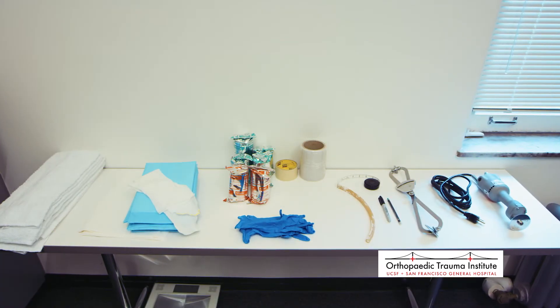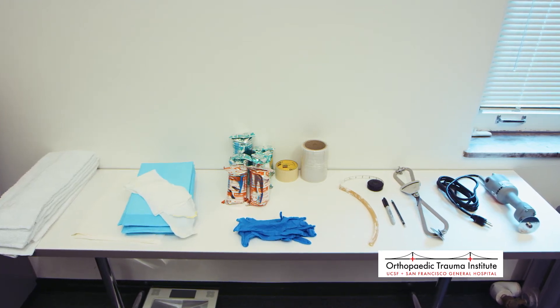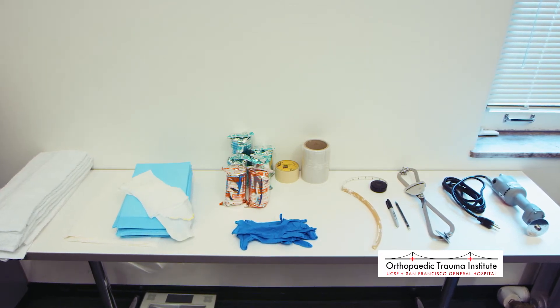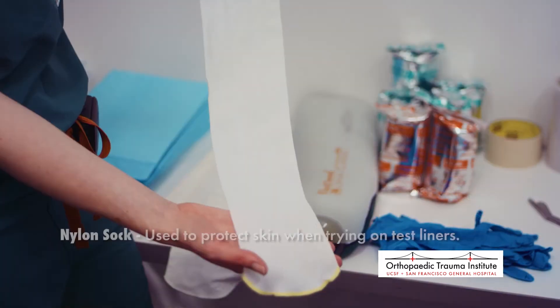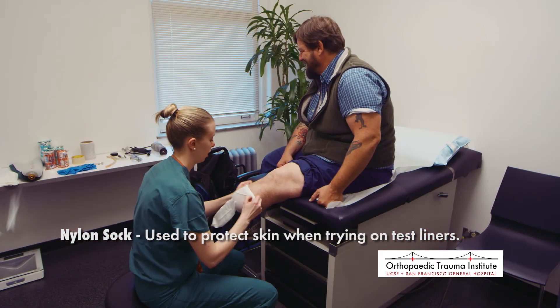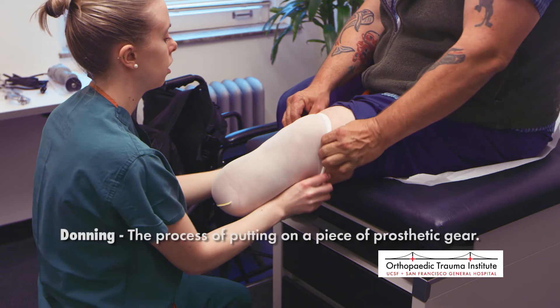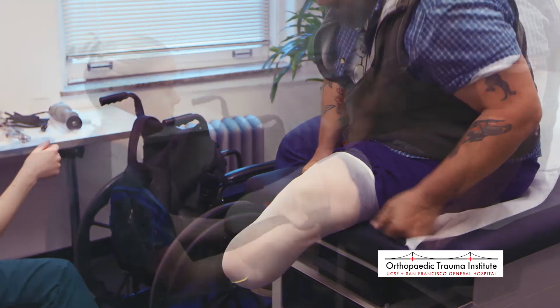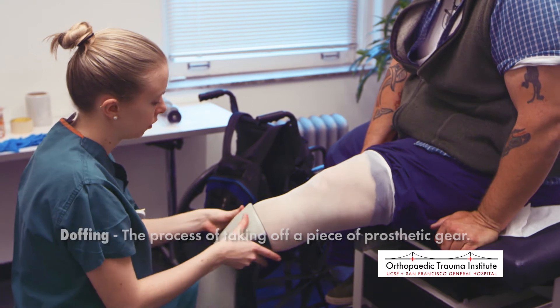On this table, we have all of our tools set up to prepare for casting — this is the spread you would see if you came for a casting appointment. The first item is a nylon sock, just a basic elastic and stretchy sock. We'll use it as a barrier to the skin when trying on test liners. Putting a sock or liner on the residual limb is referred to as donning, while removing it is referred to as doffing — these terms are frequently used.